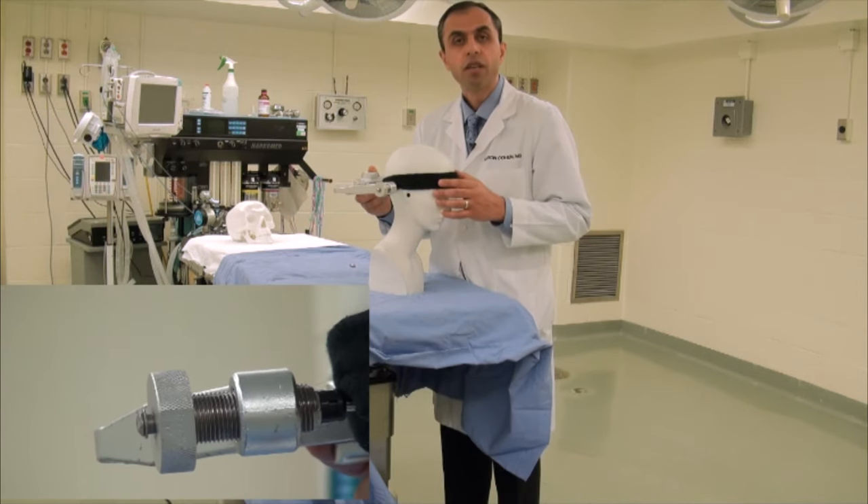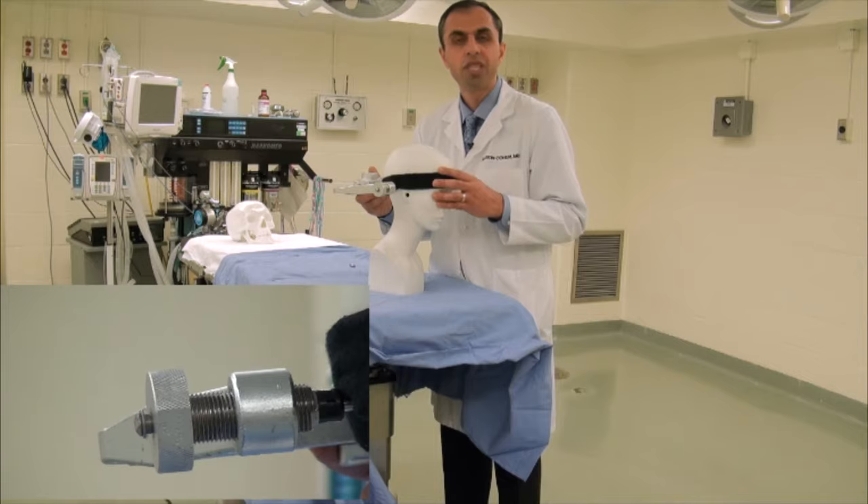It is common that most surgeons use three lines — in other words, 60 pounds.